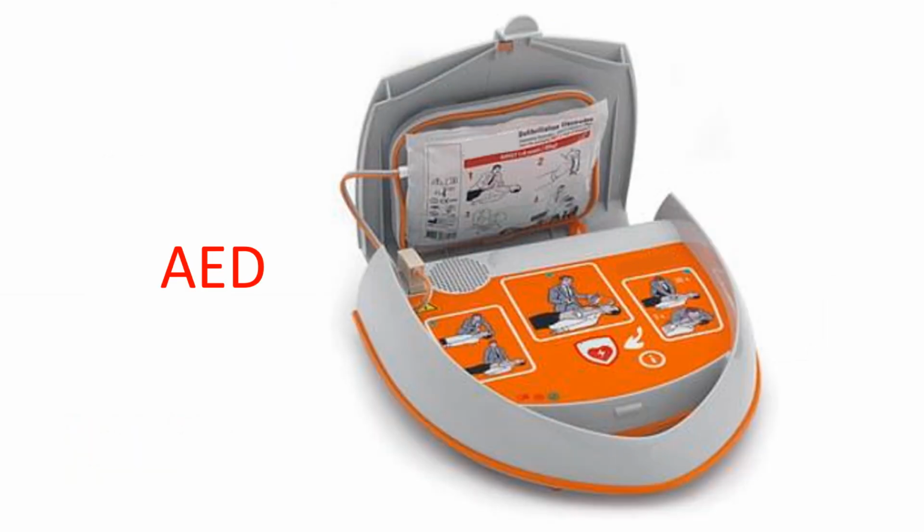What are the other special types of defibrillators? One special type of defibrillator used in public places or public access defibrillation is known as the automated external defibrillator. They are called AED in short. If the AED patches are attached to the chest, it analyzes the heart rhythm and advises whether a shock should be given or not. The user can manually deliver the shock to save the victim.